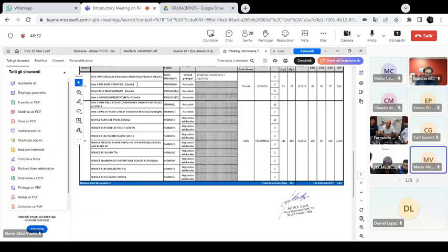Just to point out that the serial numbers are on the screen. I don't know if you can see it. Yeah, no, we know, but okay. I don't know if they want to bring a specific unit, or maybe the commission already has a specific unit in hand.